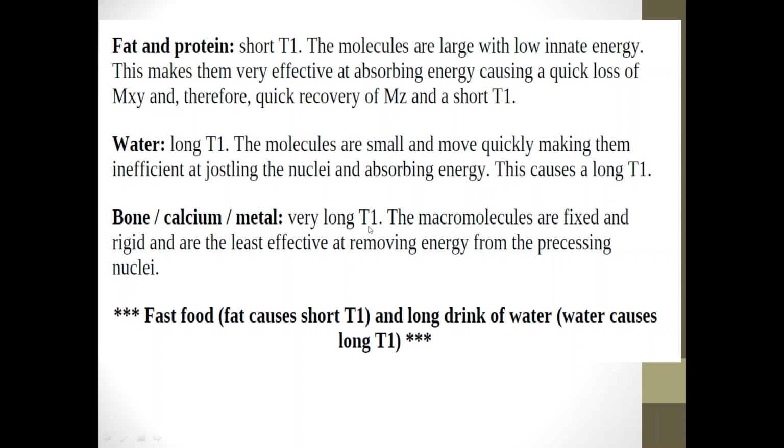If you want to understand in detail why fat and protein lose the signal very fast and water loses the signal very slowly: fat molecules move slowly, and sometimes you find dense materials, and sometimes in fat there is a double bond, which enables fat to lose the energy very fast.